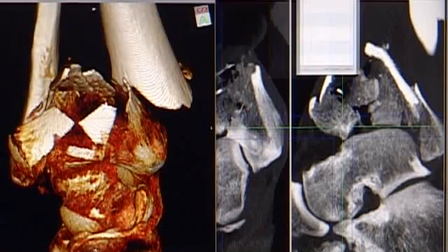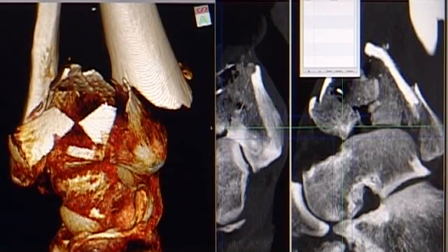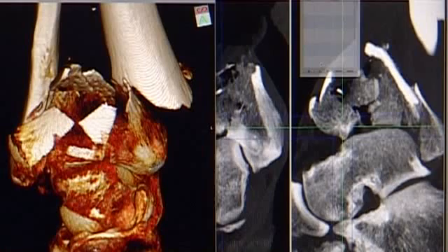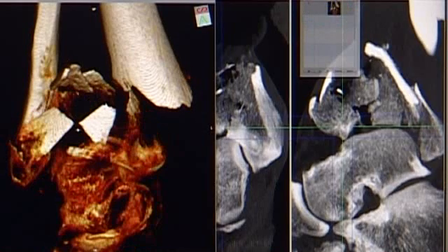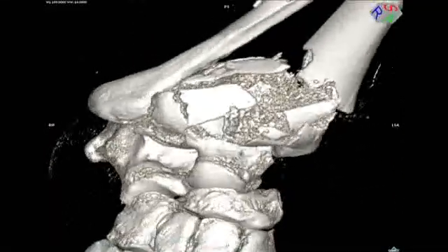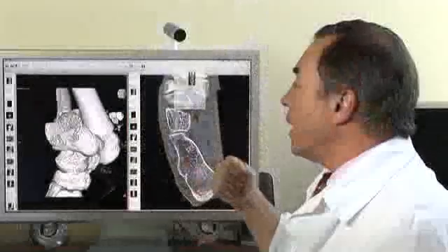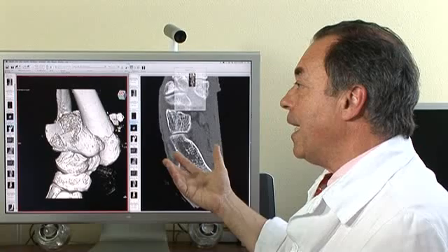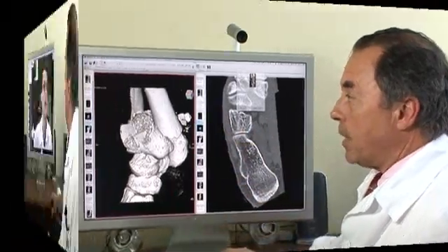Would the software let me generate my own movie of the fracture? Absolutely. You can record all this — what we call a fly-through. These images can be recorded step-by-step; you open a small scenario and say you want this image recorded, then press plus. These recordings can be saved and taken with you into the operating room, and run in real-time. OsiriX also allows you to call somebody and have a video conference with a radiologist or specialist.